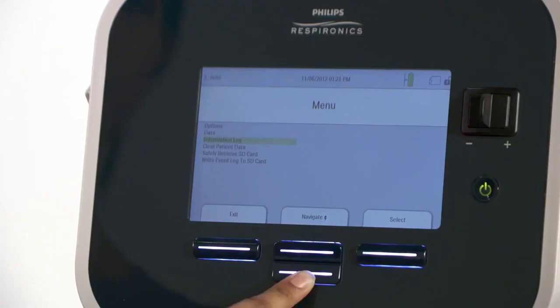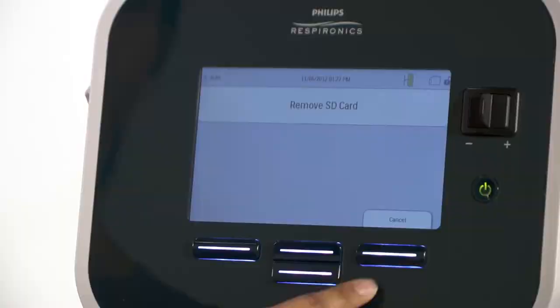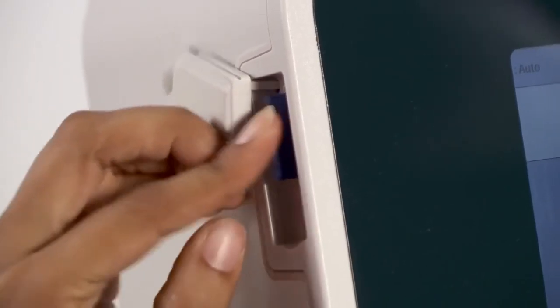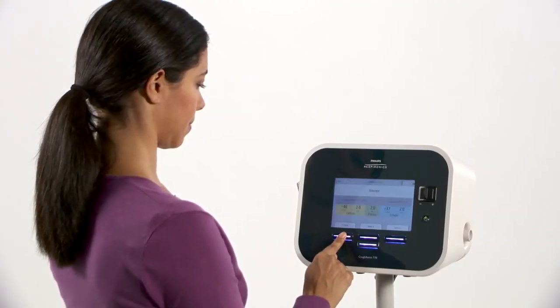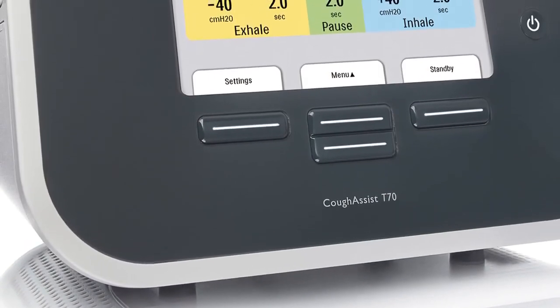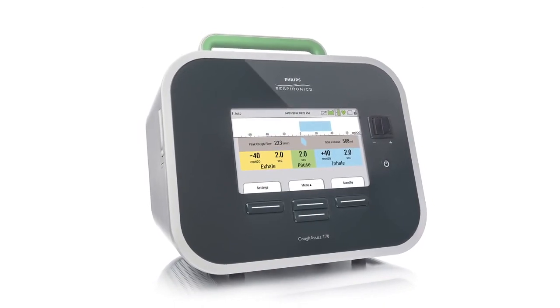Use the down button under Navigate to move down the list until Safely Remove SD Card is highlighted. Press the right button under Select. A Remove SD Card message will appear to let you know that the card can be removed. Press the left button under Exit to return to standby. The SD card and other features make CoughAssist T70 easy for caregivers and patients to use in the hospital and at home.